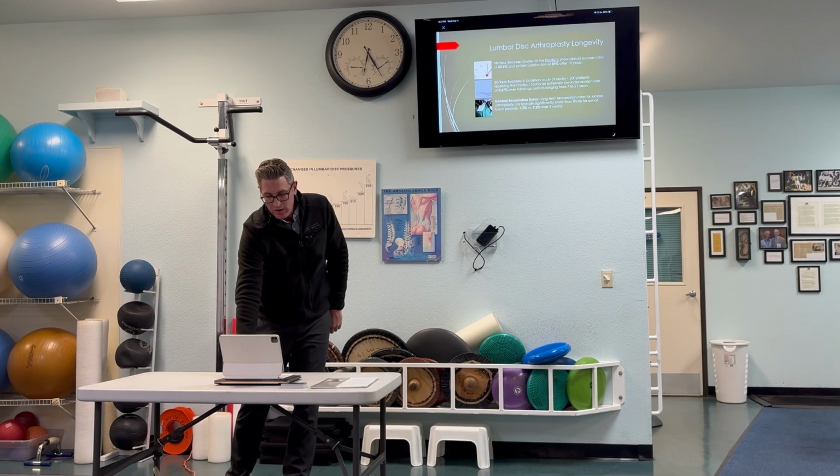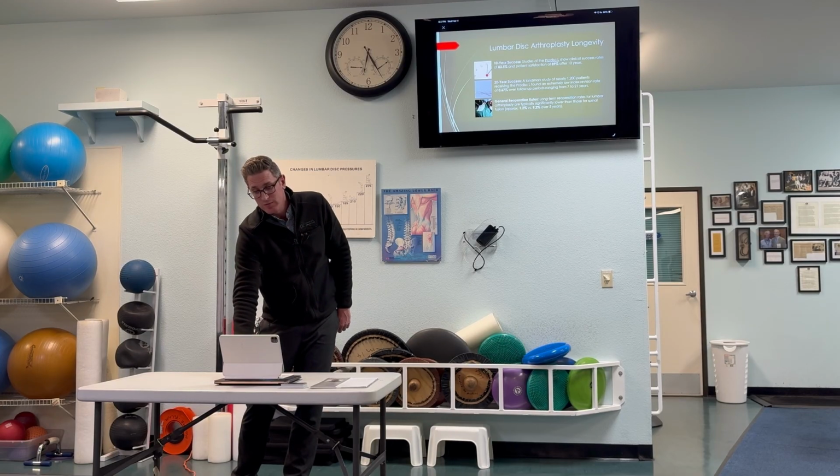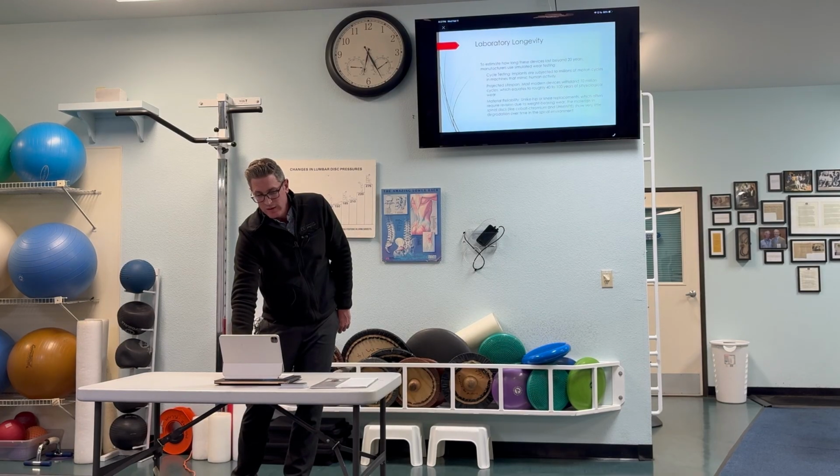And a couple other talking points here is that overall, the satisfaction rate for the ProDisc L is about 90% at 10 years, which is really good, and the revision rate is quite low. Overall, about 1% versus 10% for a spinal fusion, so substantially less.